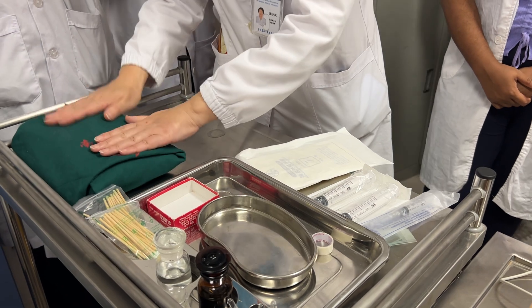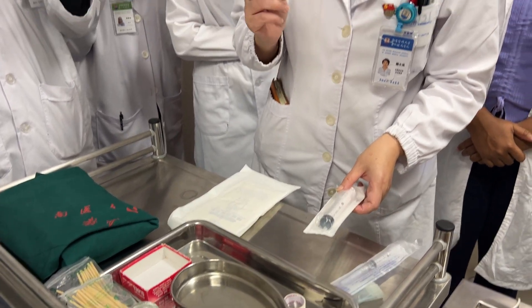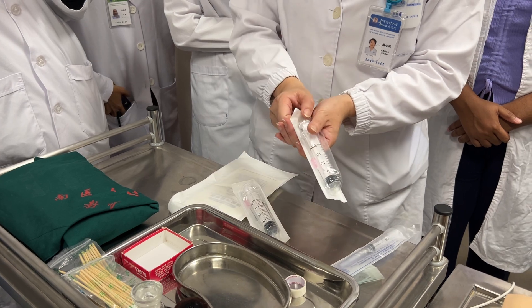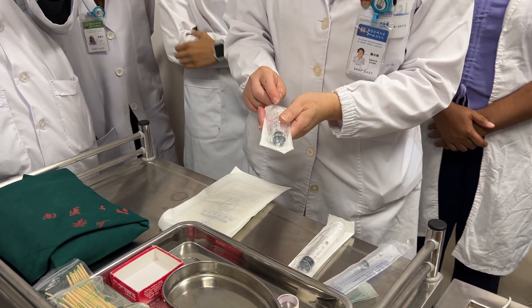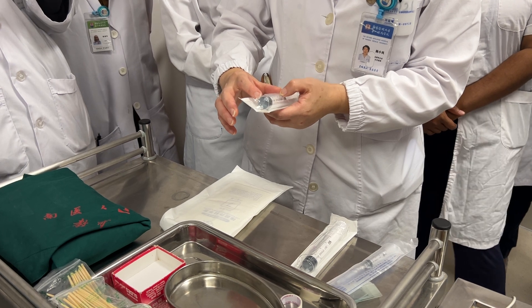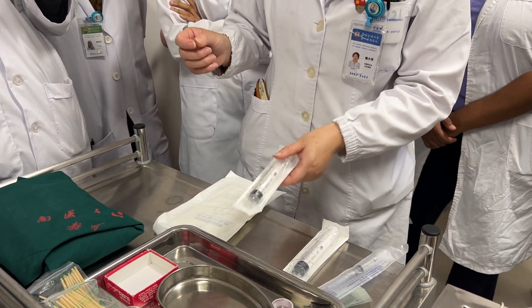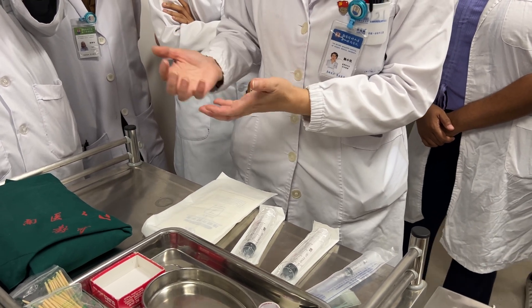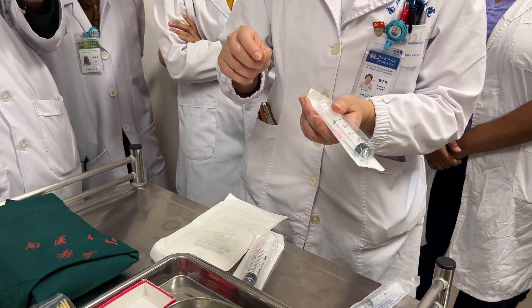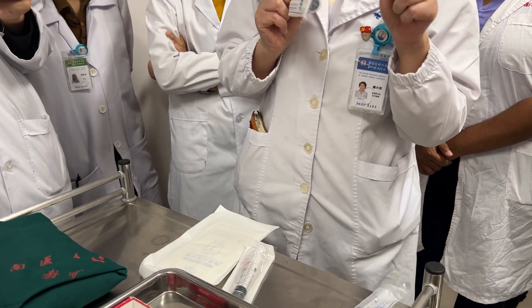This is the bone marrow puncture needle kit including gloves. Sometimes we get two syringes: one is 20 milliliters for the aspiration, and we may add some heparin into the needle — about 10 to 15 milliliters for the gene test or chromosome test. For the bone marrow smear, only 0.1 milliliter is needed.